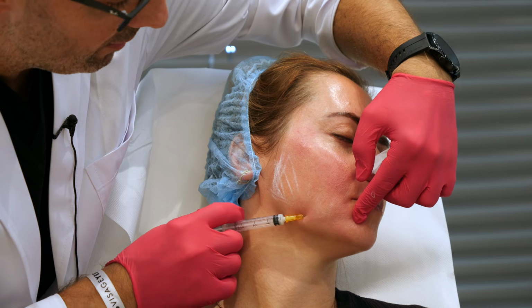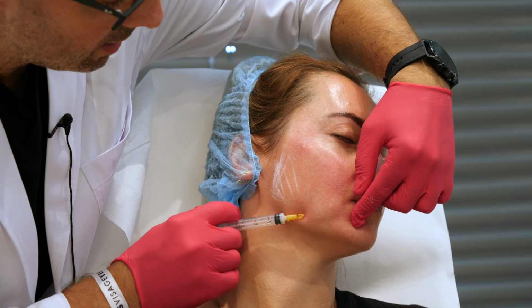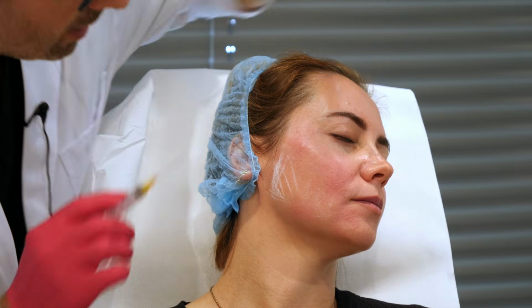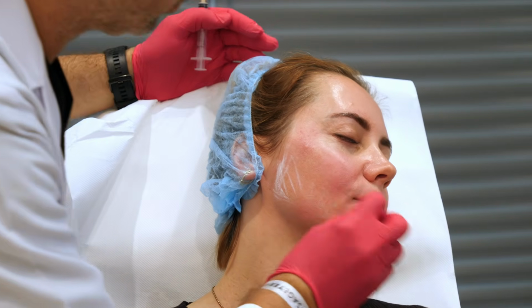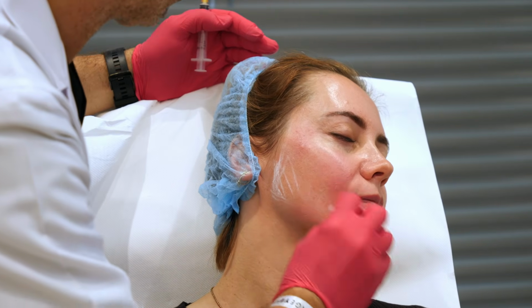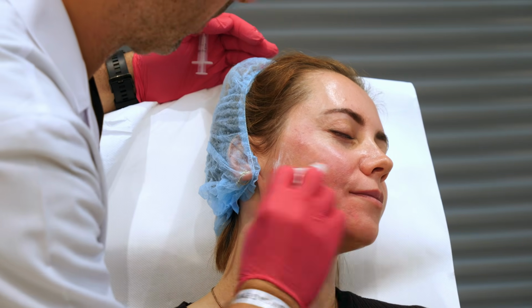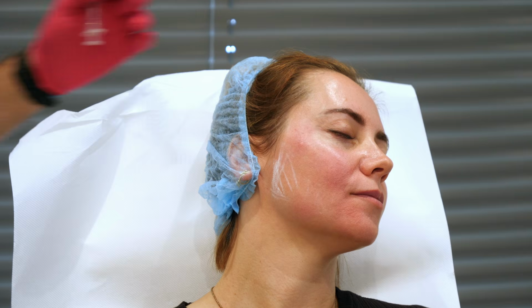You can feel where you are with the cannula and when you stop, okay?